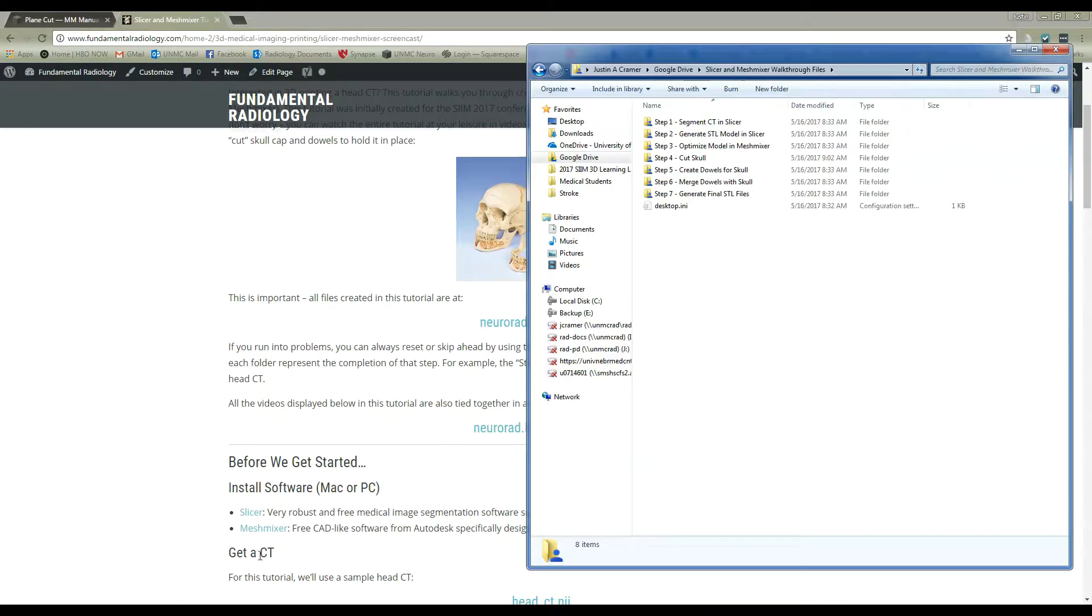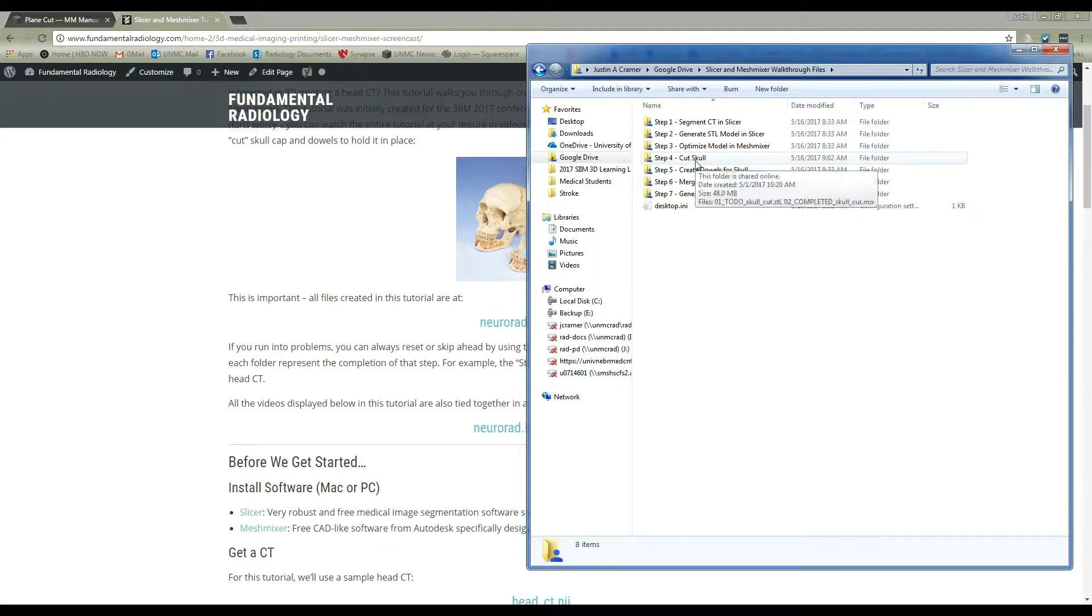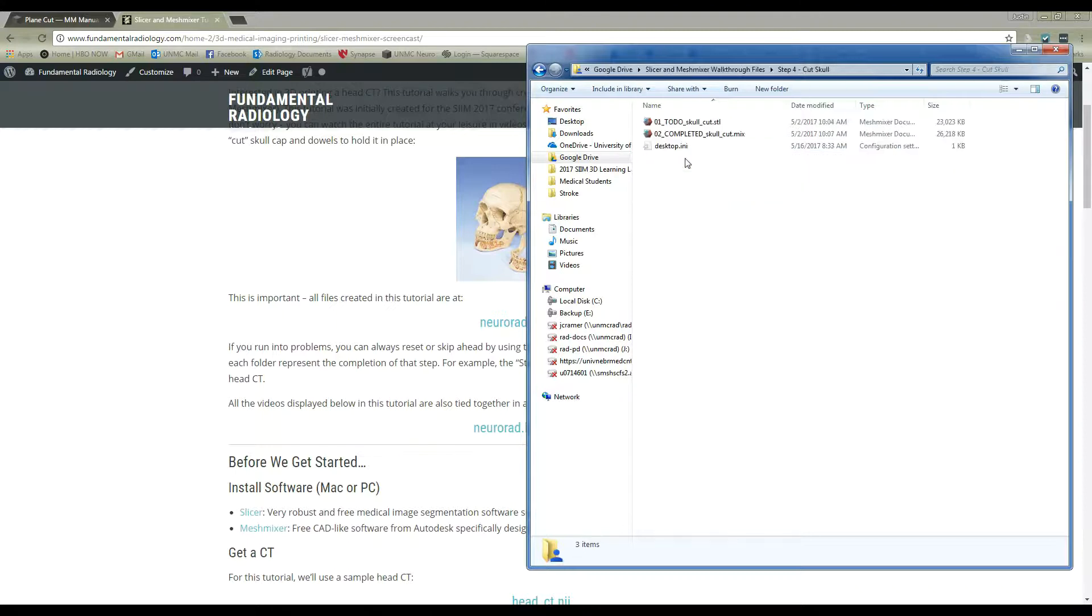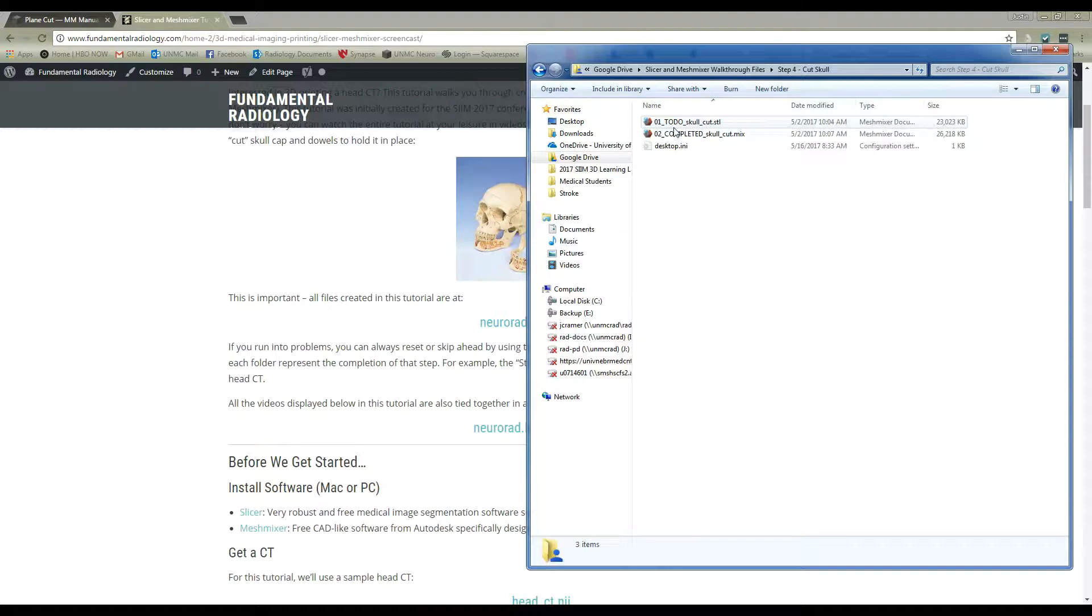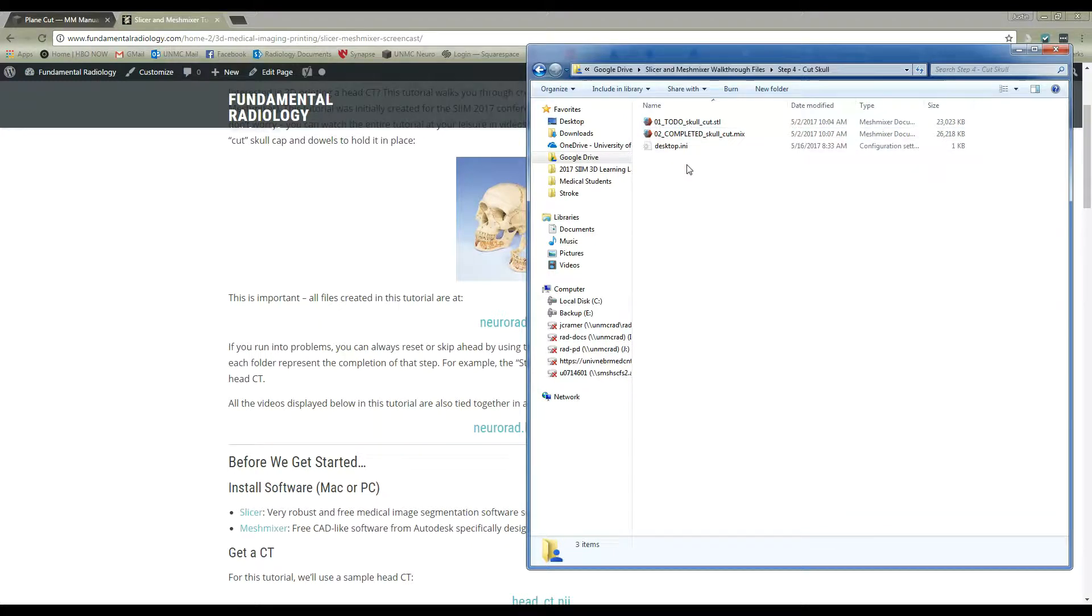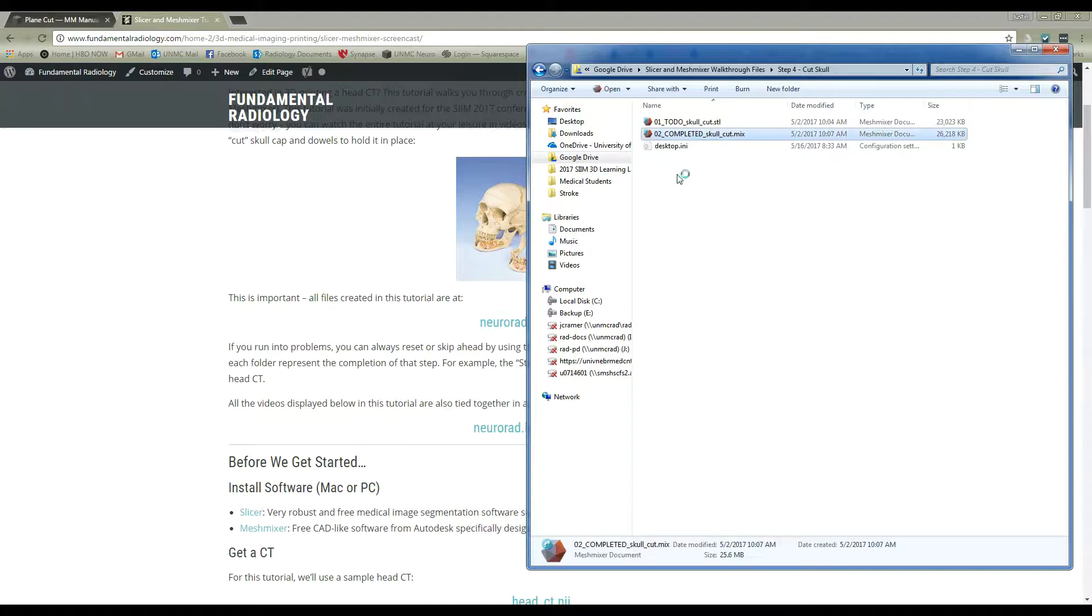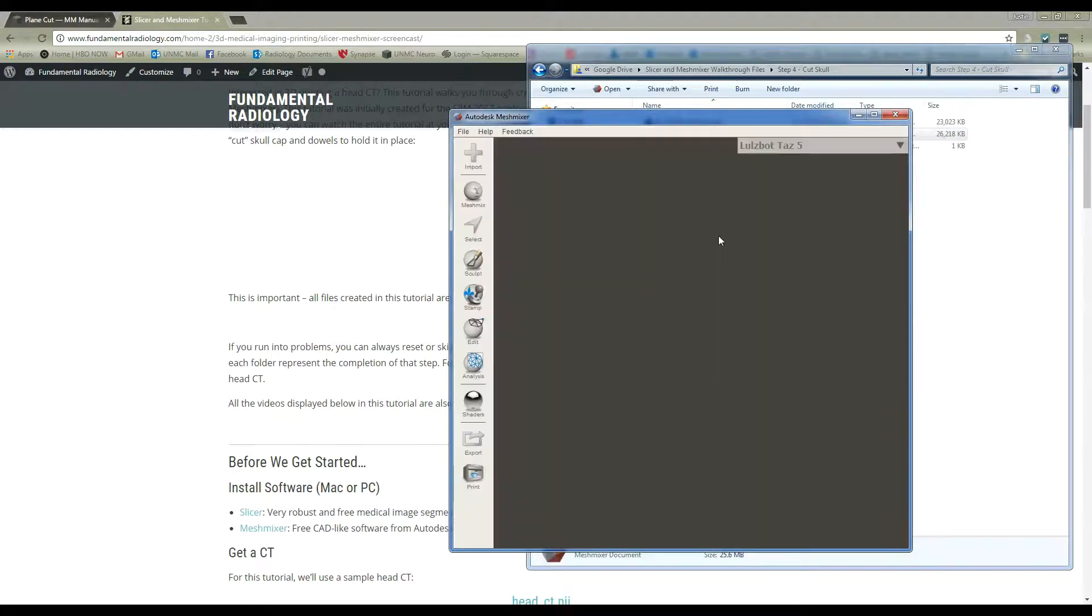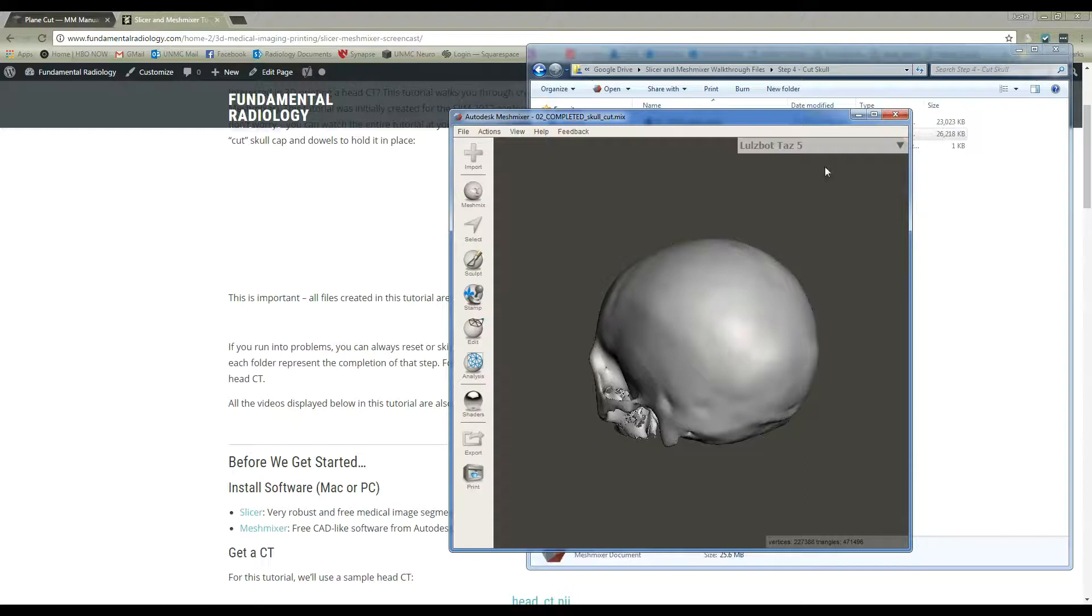So we're going to be doing step four, which is cutting our skull model that we've created. You can see here I have all the different files and folders downloaded for this tutorial. I'm going to go into step four, cut skull. You can see there's two files here, to do cut skull. If you want to follow along and do it yourself, open up this file by double-clicking or importing it into MeshMixer if you have a Mac. I'm actually going to make this file, so I'm going to click the completed skull cut file and open it up in MeshMixer here.